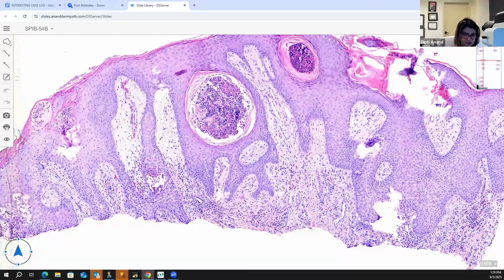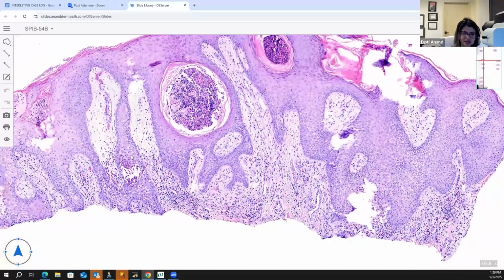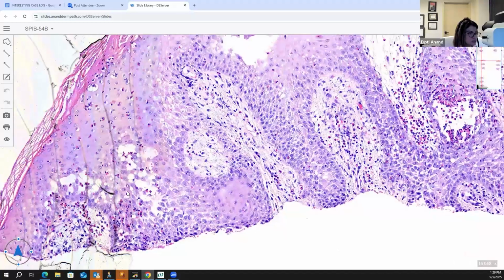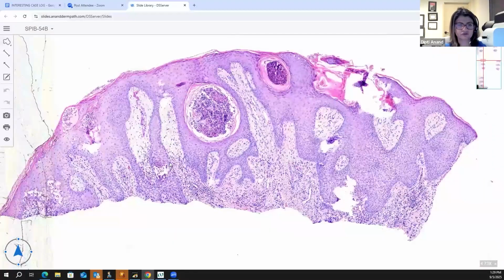Microabscess, thick epi, plasma cells because of the location may not be present. And then you go back into the biopsy and you look for those subtle changes. There is very subtle acantholysis in here, which would have been very difficult for me to explain to you guys. You see here how it is splitting off? That is why I put the second part of the slide in there to show you, because there it was really good, but this is pemphigus vegetans.